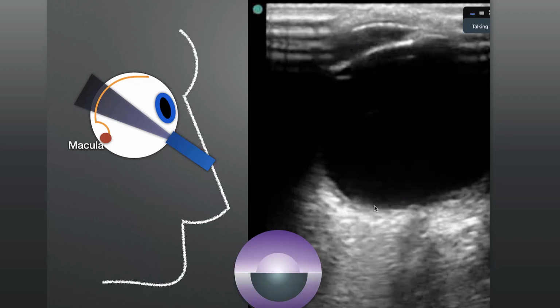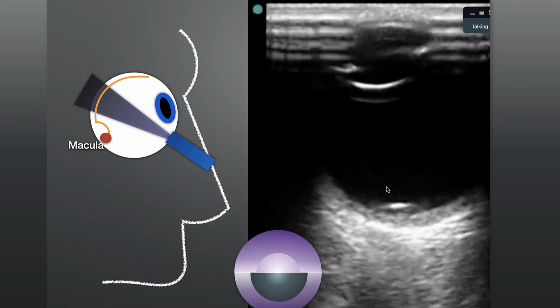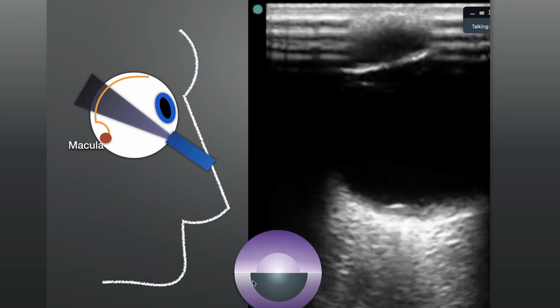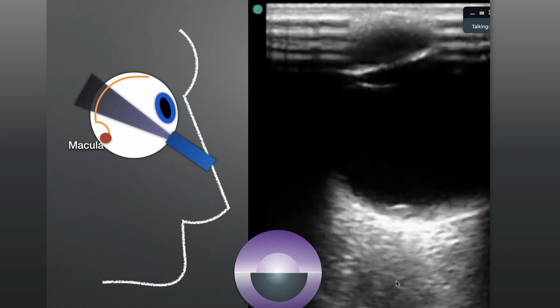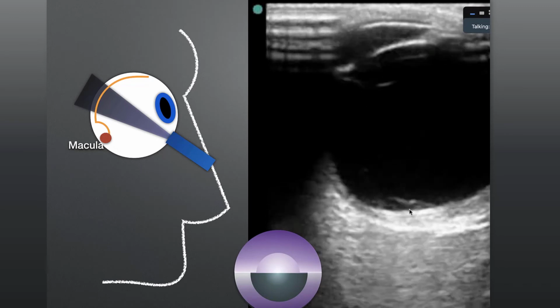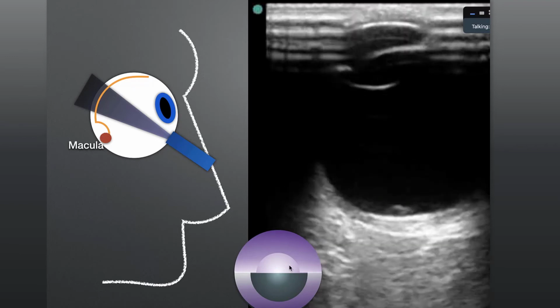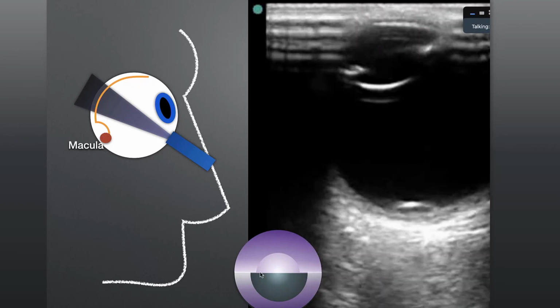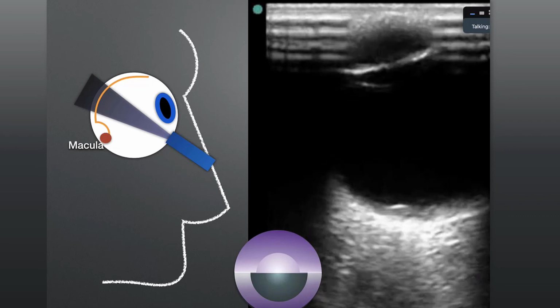This is a patient who had a tiny tear, but it was sadly involving the macula right away. So here's his little retinal tear. He had already lost inferior vision in the lower portion of his central vision. So even though it's a tiny tear, this patient was fairly emergent and was taken to the operating room quickly because the tear is directly affecting his macula. If he loses any more of it, he will probably not be able to read with this eye.